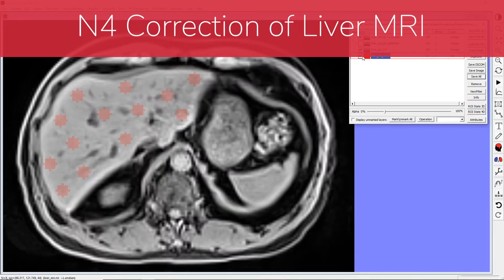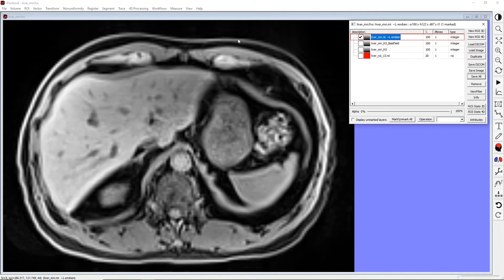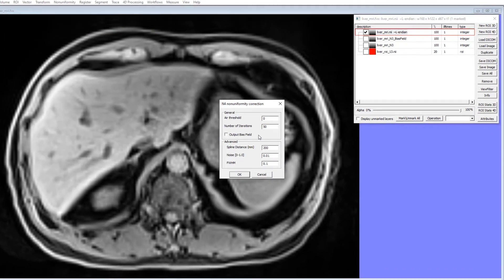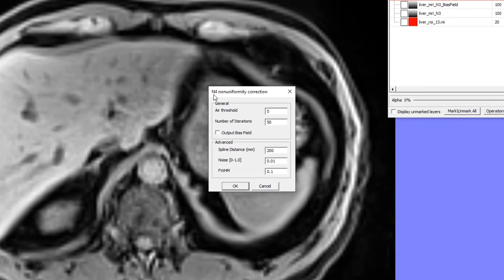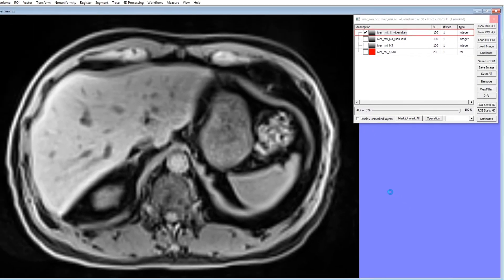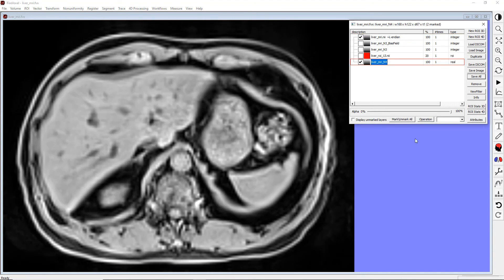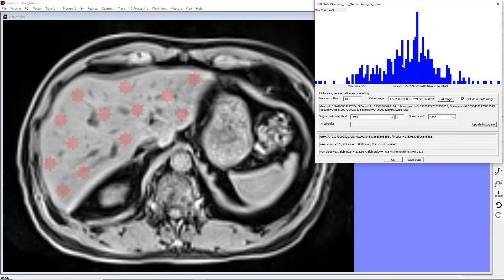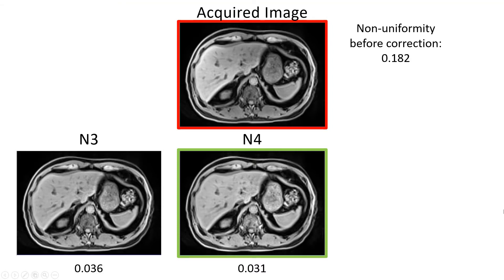Next, we will use the N4 correction method. Make sure that the base image is active, then select Non-Uniformity N4. This will open the N4 parameter panel. Similarly to N3, the key parameters here are the number of iterations, the spline distance which determines smoothness, and the full width at half maximum. This operation will create a new layer with the corrected image. Open the ROI statistics. The histogram of the N4 corrected image shows a single peak, and the non-uniformity is reduced by about 6 times compared to the original image. Here is the N4 corrected image next to the original image and the N3 corrected image.